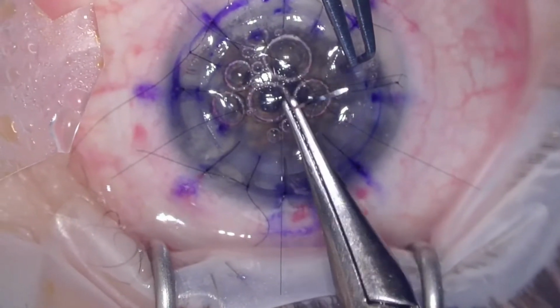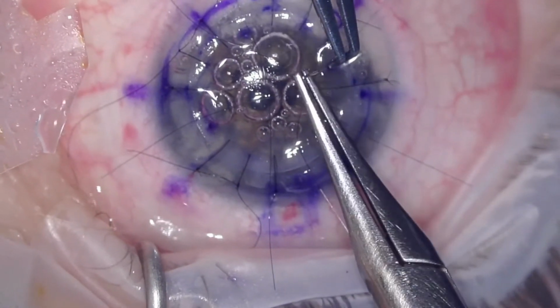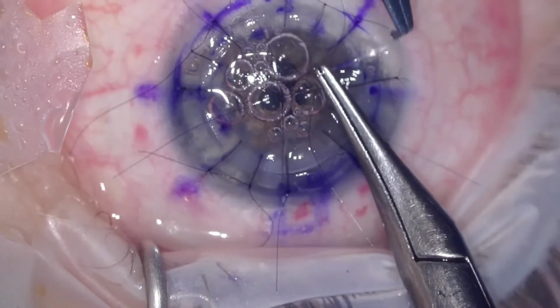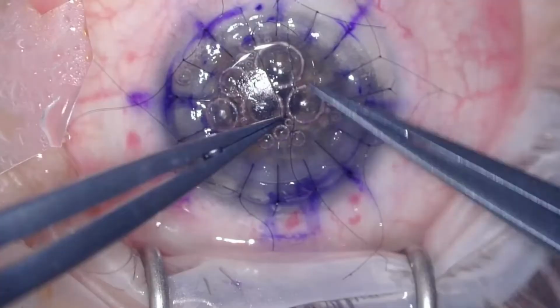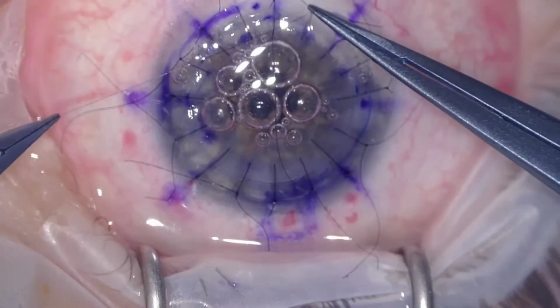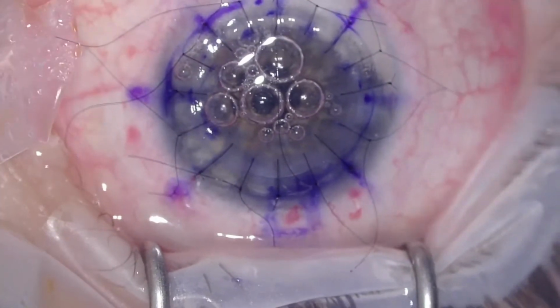But during the recovery phase, before the sutures are removed, the cornea tends to be slightly flat, so the patient tends to have a slight hypermetropic shift. I'm trying to move away from this practice, so I'm trying to suture at a normal tension rather than over tighten nowadays. But in this case, I have over tightened a little bit to make the cornea as flat as possible to push it into the space that's created.